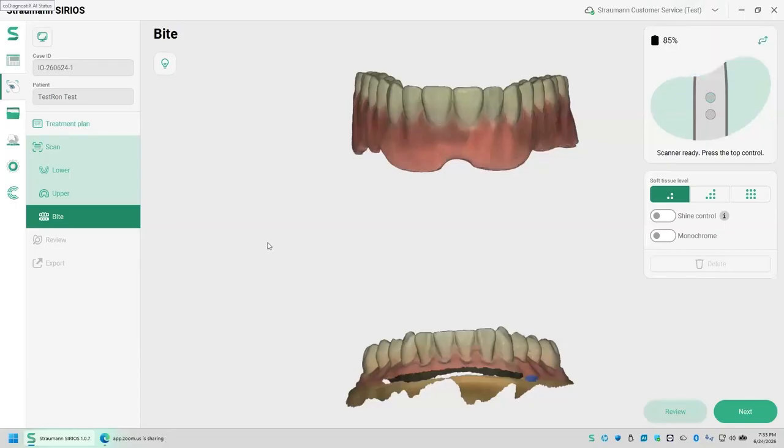Okay, and Ron, yes, we did have a question. Sure. One of the doctors is asking, could you rub articulation paper on the palate or use sort of a marker? So yes, tissue markers, articulation paper, yes, because these scanners today, and maybe I've been scanning too long, but the scanners today are scanning in color. Yes, if you can add any texture in the form of a tissue marker or articulating paper, that absolutely will help. I don't happen to have one here, but yes.